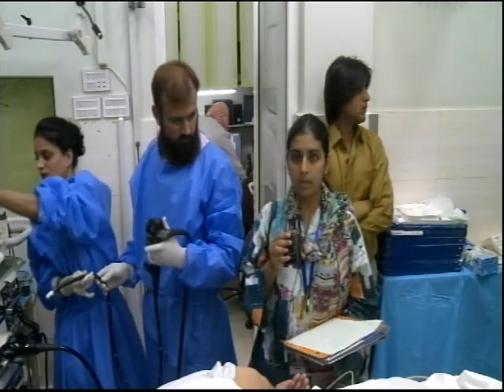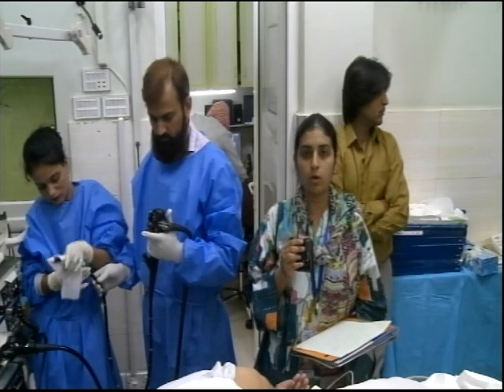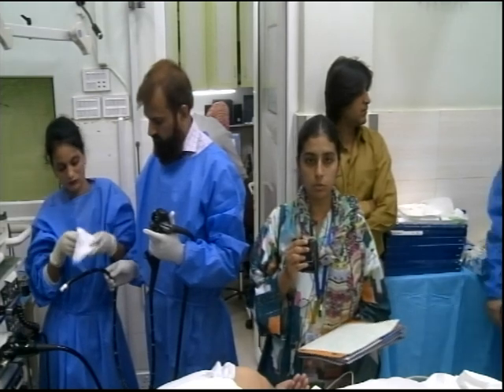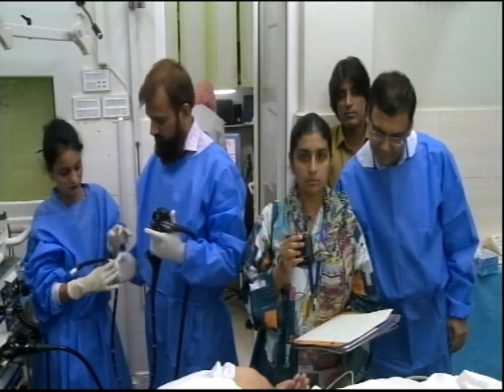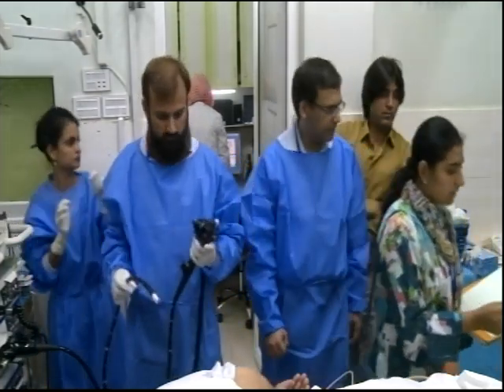40 years old female presented to us with on and off abdominal pain and weight loss for past 3 months. Her CT scan abdomen with contrast shows a 2.4 into 2.2 centimeters mass in head of pancreas. So it's CA head of pancreas likely. Suspected, yeah.